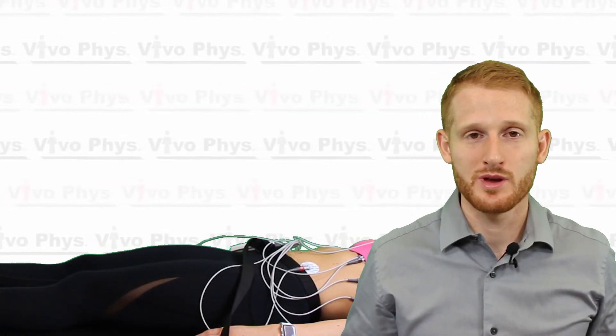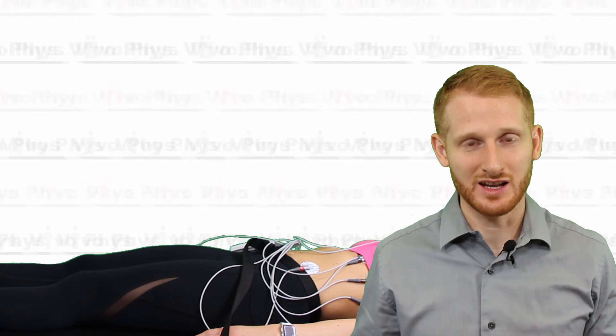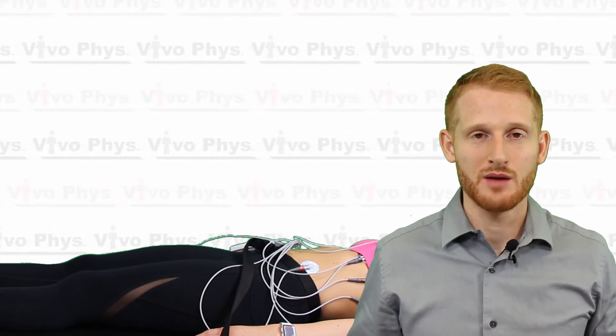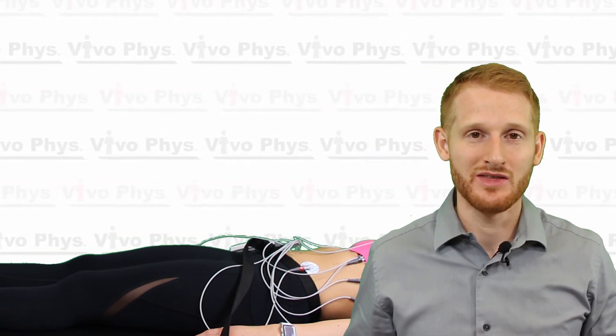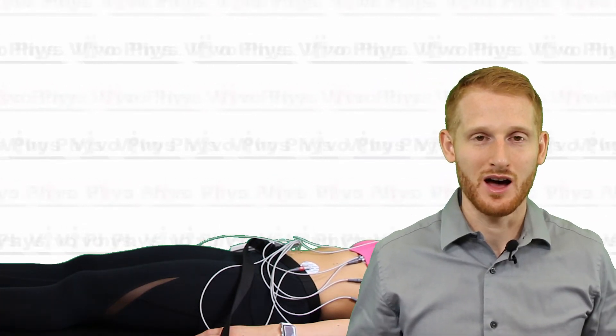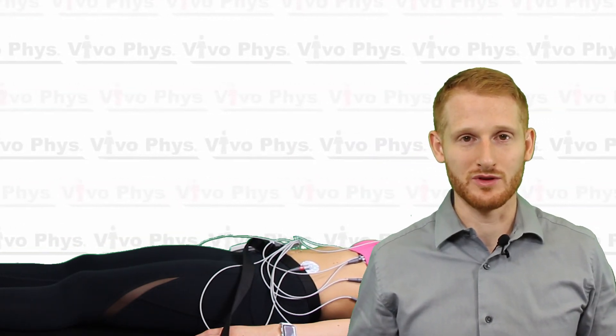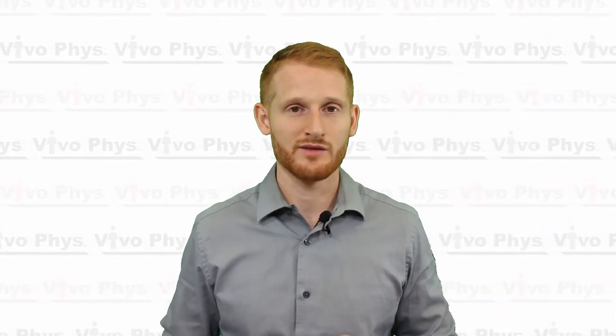In this demonstration the person is standing while we apply the electrodes — that's just to make it easier for you to see. Many people do prefer standing, but I recommend having the person lie down so they're already in the resting position for the electrocardiogram, minimizing adjustments once they do lie down. It's also a little easier on the participant. If you have any questions, please put them in the comments below and I'll try to get back to you. Otherwise, please come back and watch another video. Thanks.